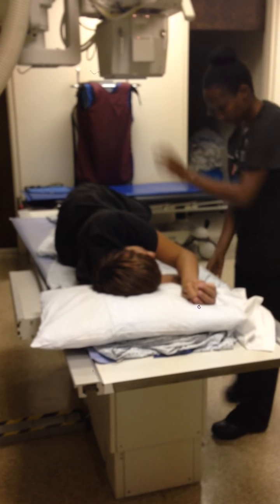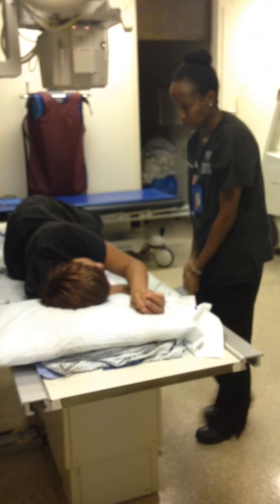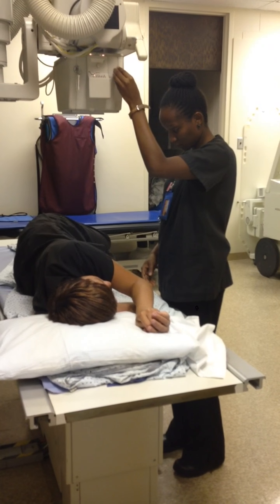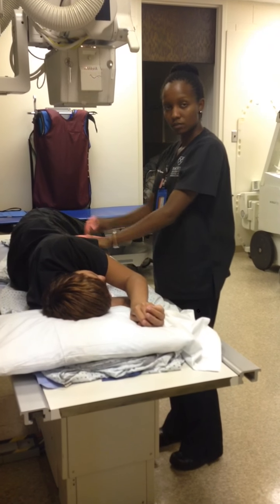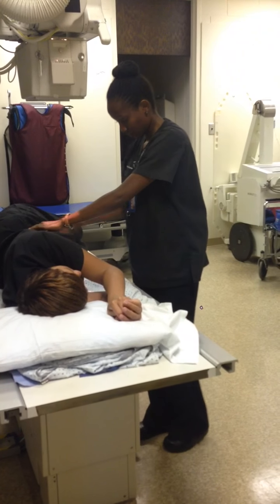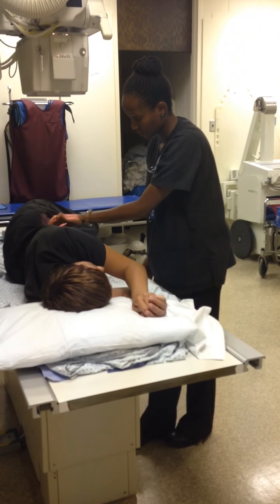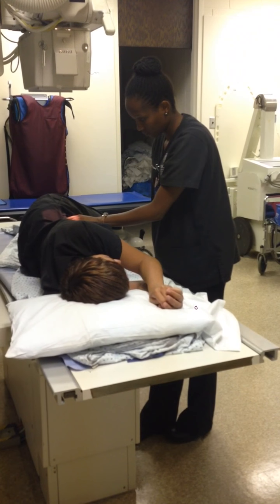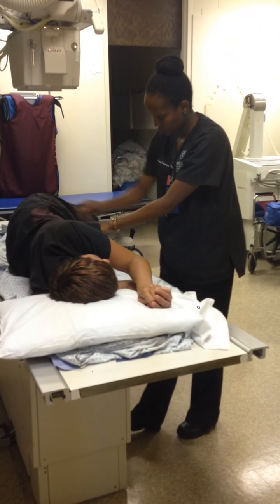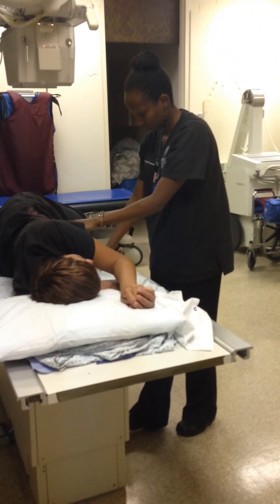The cassette size is 14 by 17 lengthwise and will be collimated to an 11 by 17 field size. The central ray is perpendicular to the image receptor and centered to the pylorus. To localize the pylorus, center 1 to 2 inches above the lower rib margin and halfway between MCP and the anterior border of the abdomen. Place the right marker on the lower corner of the light field, either on the tabletop or on the cassette in the bucky.